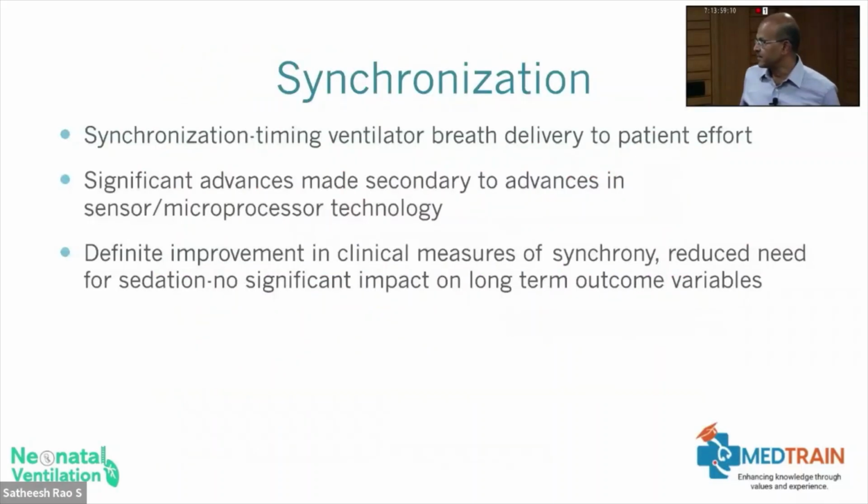Synchronization is a very important concept to understand, and in the demonstration session, the clinical application specialist will show you how the flow sensor works and what the synchronization trigger options are. Synchronization basically means we are timing the ventilator breath delivery to the patient effort, and that's the most crucial advance in ventilation in the last 25 years or so. Because with synchronization, in the past 15 years, most NICUs moved away from routine sedation. When I was training, we used to give morphine for any ventilated baby as a routine. But now we don't prepare morphine even for most of these babies. That's only possible because we have synchronization.